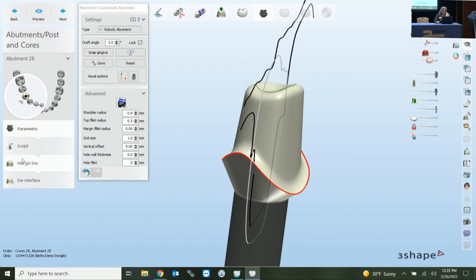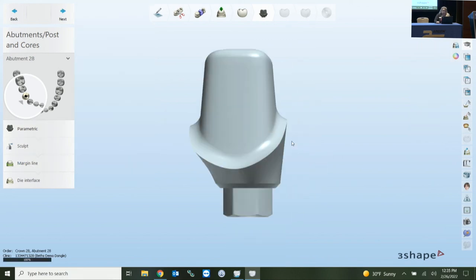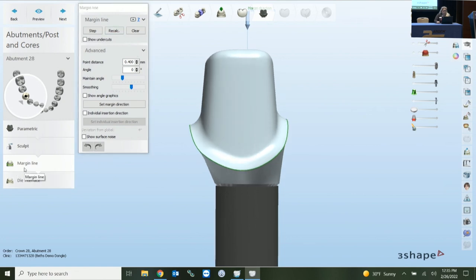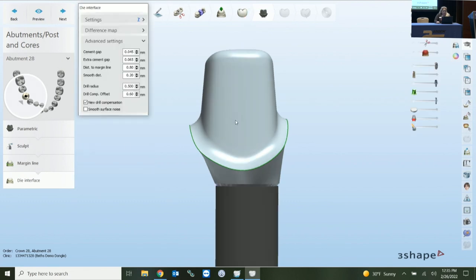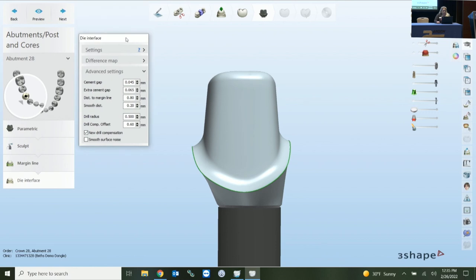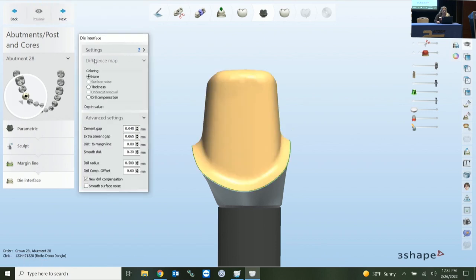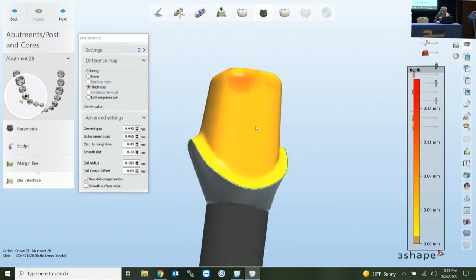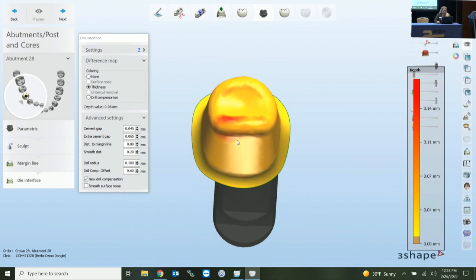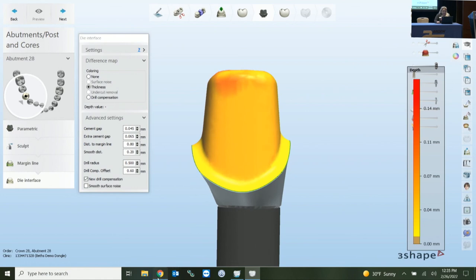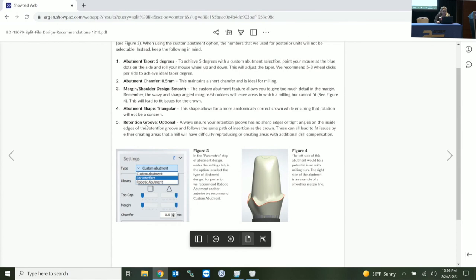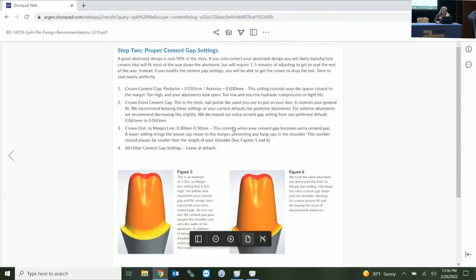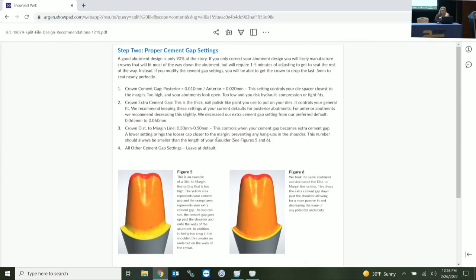Those are your main players for abutment design — that's 90% of the success. The margin line is already set, and now we get into die interface for your crown. Previewing the thickness, anything in red indicates it may have trouble with a heavy drill radius reaching in there. You don't want wavy margins in your crown settings. The three main players for crown fit are: cement gap, extra cement gap, and distance to margin line. These are specific settings for the split file.